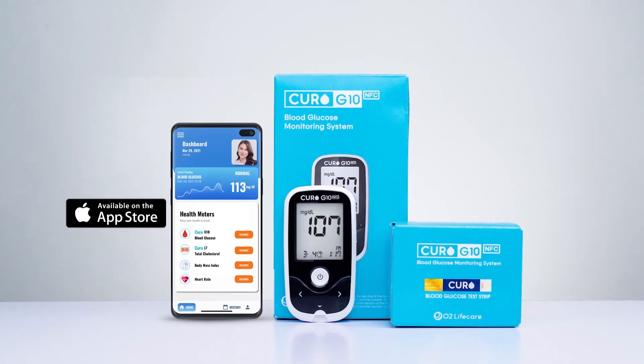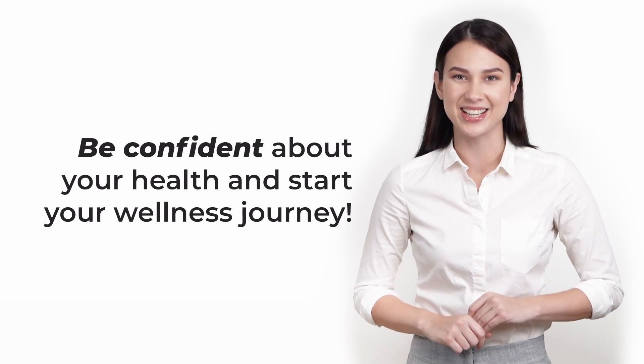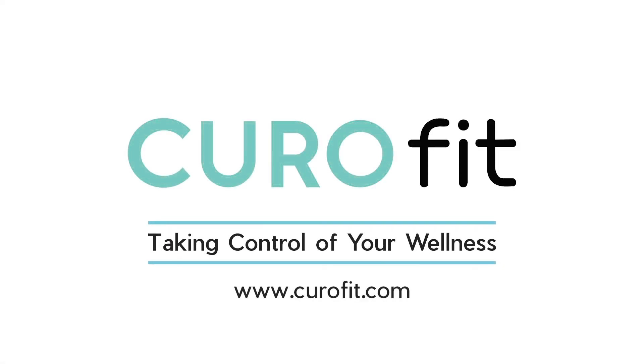Available on both iOS and Android devices — how convenient is that? Be confident about your health and start your wellness journey. Order your Curo G10 by Curofit now.